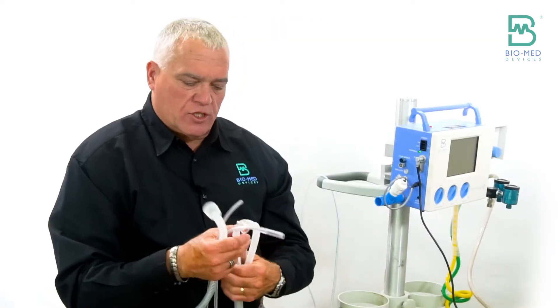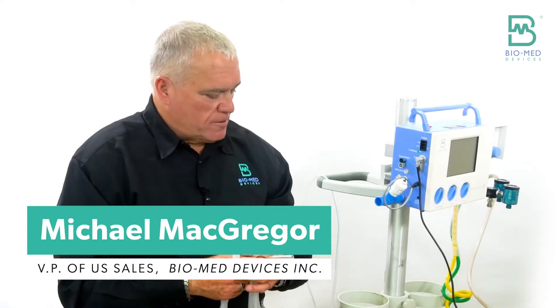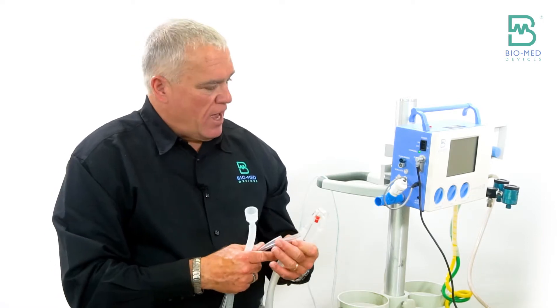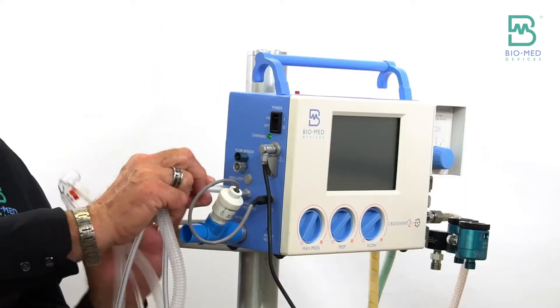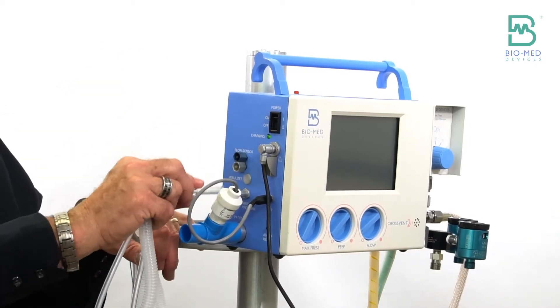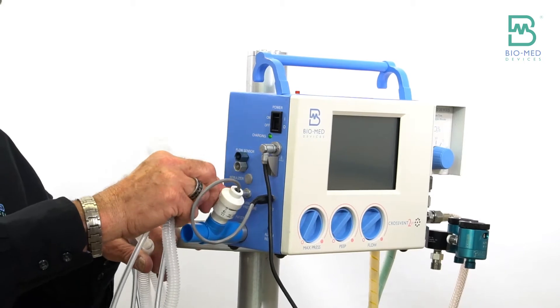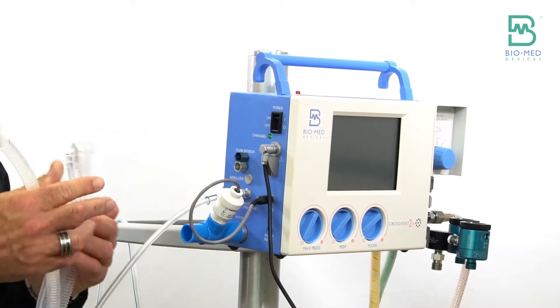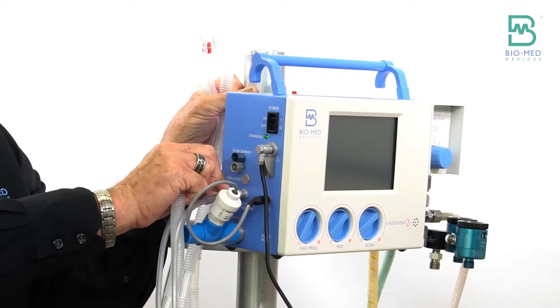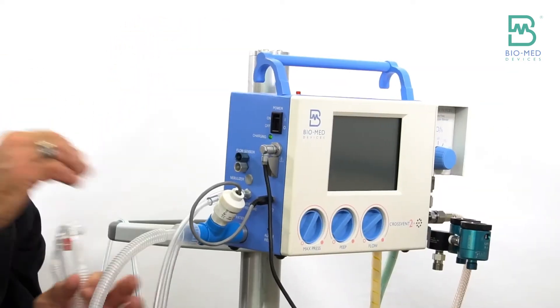I'd like to talk about the circuit connections on the Crossvent 2i Plus. The standalone version actually has a different size fitting for the pressure line here. It's a bigger fitting and the exhalation valve won't fit — that's just to keep them separate and make sure everybody connects them correctly. And then it has a 22 millimeter connection here.